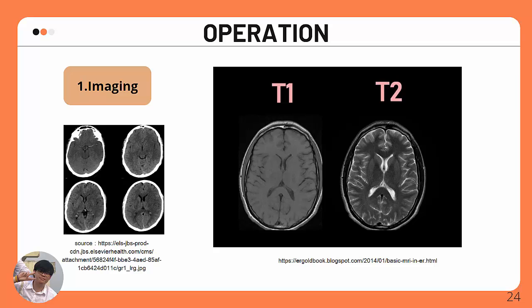The operation of implanting can be divided into 4 main parts. The first one is imaging: getting a couple of MRI sets, volumetric 3D, T1 and T2 turbo spin echo, and imaging from the CT scan. Then the doctor will determine the target for implanting the DBS leads. Comprehensive functional and anatomical information-based targeting seems to be the best way of targeting the stimulated area. Using a brain atlas, T1 and T2 maps, neurophysiological information, and real surgical data increases the accuracy of the doctor's decisions in targeting.